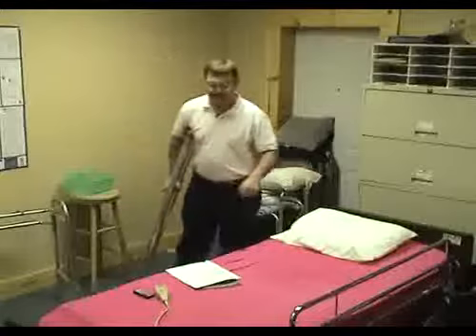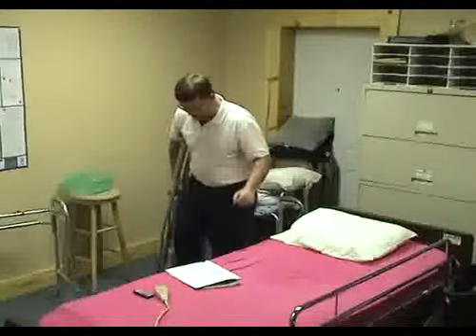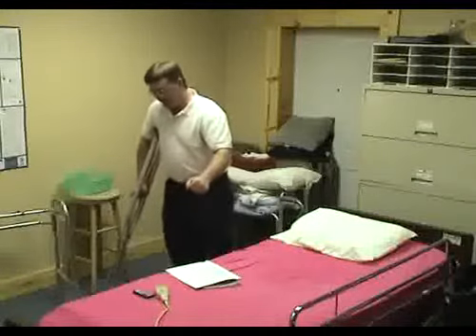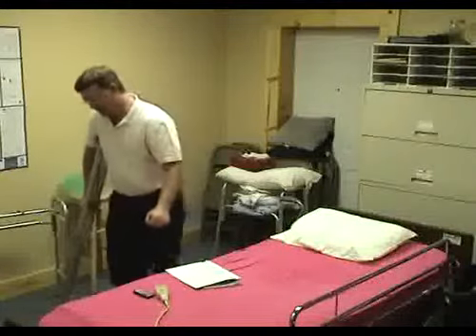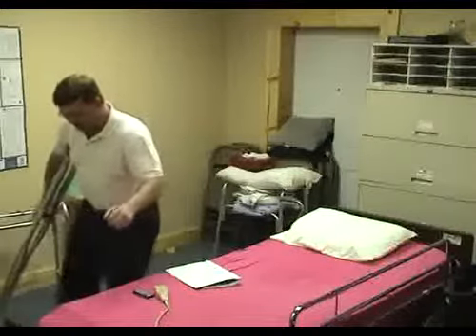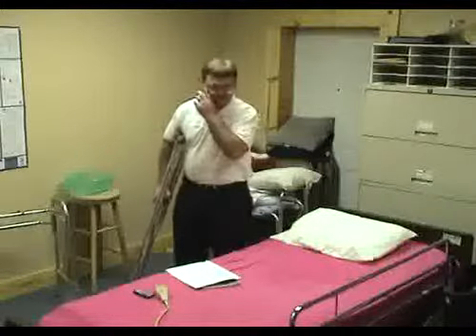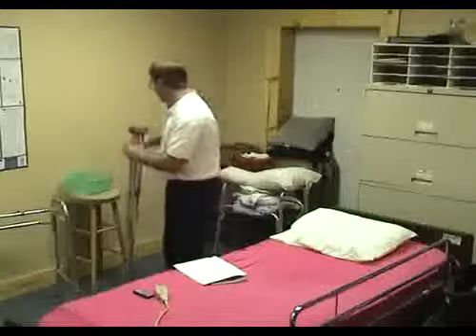Coming down with the bad is if you could put some weight on it. You would go the bad foot first, and then with this and the handrail, and then bring the good foot down second. Bad foot down, all 3 of these come second. Normally it works best that way. Okay, for the walker.